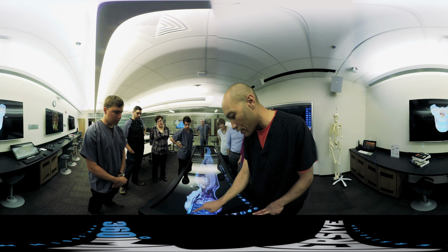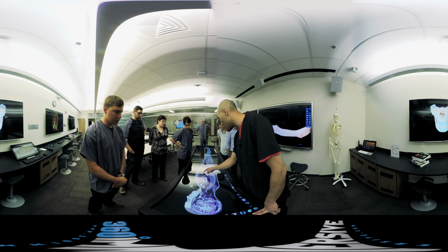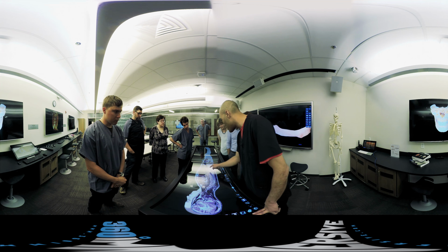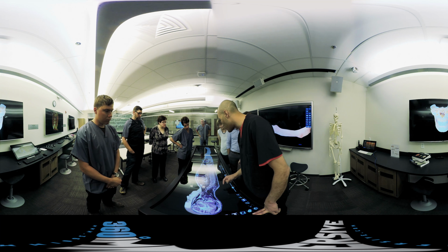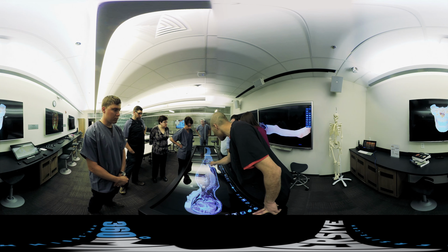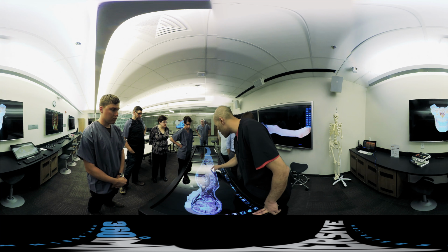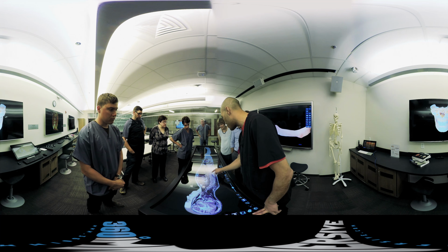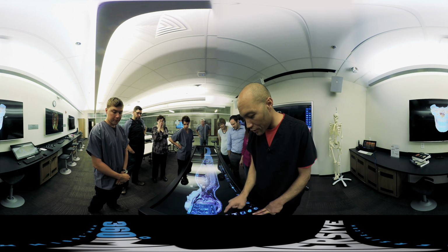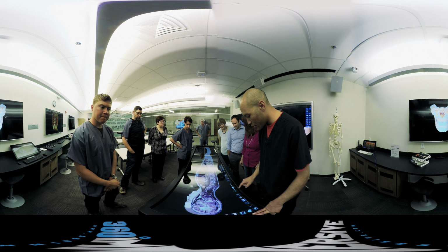I can annotate directly onto the screen and we can highlight structures like the liver here, or we can see and appreciate the diaphragm. That's kind of fun. You can see some of the gut tube structures dotted along. We can appreciate things like the sacrum right here, or L5, 4, 3, 2, and 1, and then there's T12. You can see the spinal cord ending right about at the L1 level. Let's clear those things out of there. That's pretty fun to do.